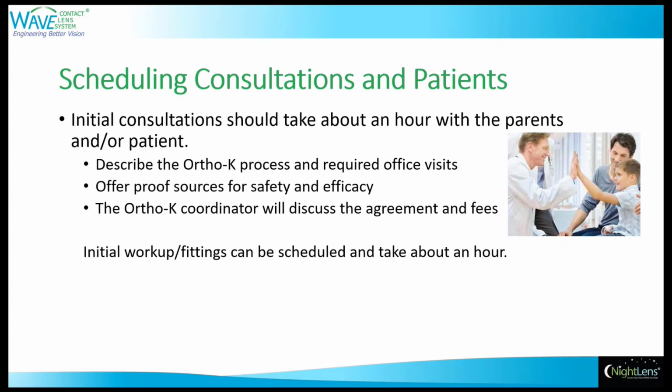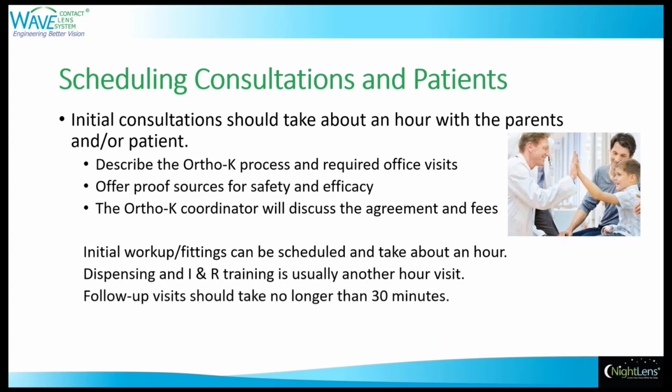So after the patient has accepted and wants to begin, the initial workup or fittings can be scheduled and take about an hour. The dispensing and insertion and removal training is usually about another hour. Once the patient has been dispensed and they're starting their follow-up visit schedule, your follow-up visit should take no longer than 30 minutes. And once your staff is properly trained, they can manage the majority of these visits.